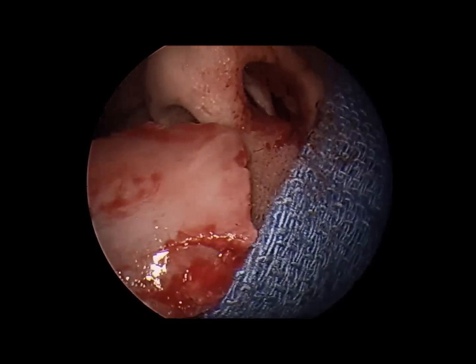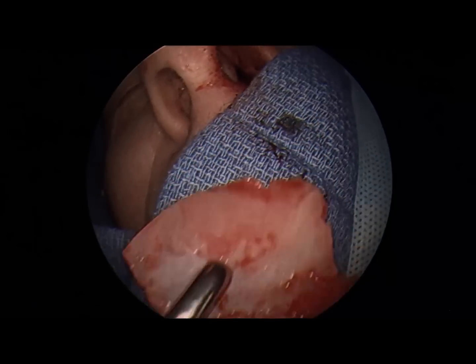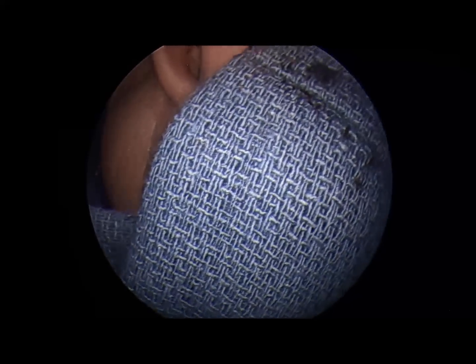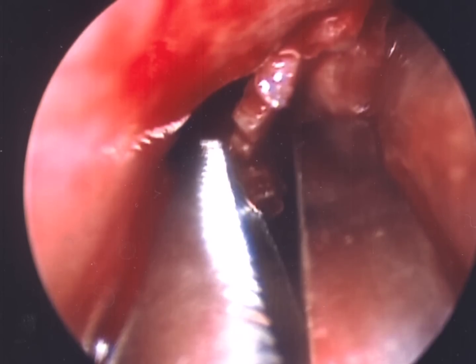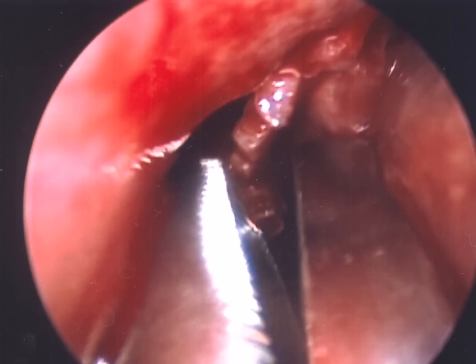Double action scissors will be used to cut the bony septum superiorly, and then the deviated bone below this will be removed, typically in a piecemeal fashion, utilizing grasping forceps as well as cutting forceps, as depicted in this still image.